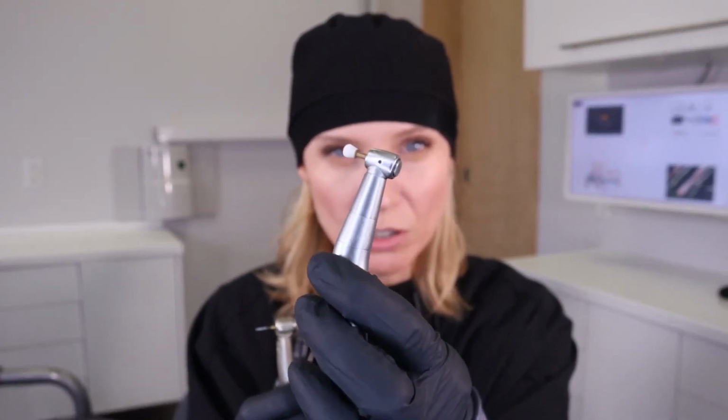So I'm really careful. And one of the other things I really notice from a dental perspective is that if the patient starts to feel something, they will generally always feel it if I'm using the high-speed one. But if I'm doing the slow-speed dental drill, they'll actually have no pain. So for very simple things, sometimes I can just clean the tooth with the slow speed and I don't need to give as much anesthetic, or the patients just won't have as much pain. For whatever reason that is, I just find it really interesting, and I always try to manage my patients' pain, comfort, expectations, what are they experiencing? All the time I'm explaining as I go.